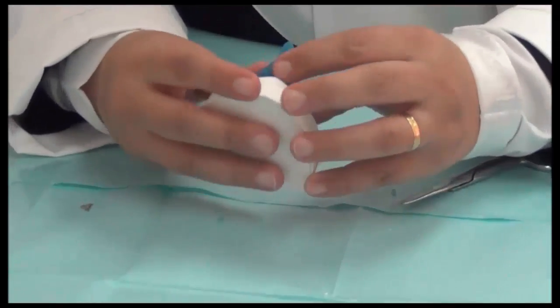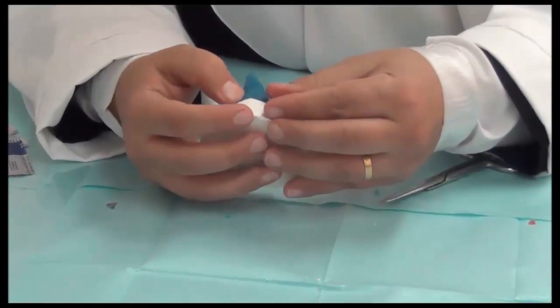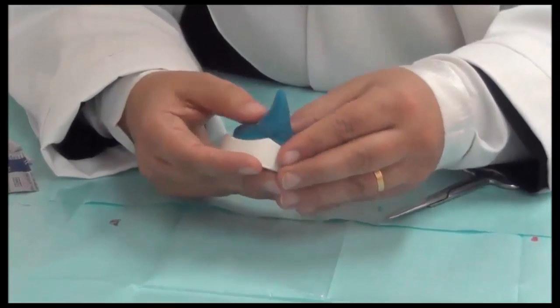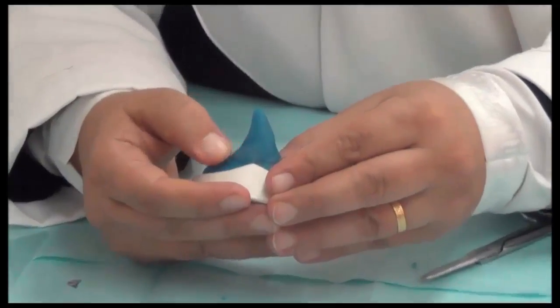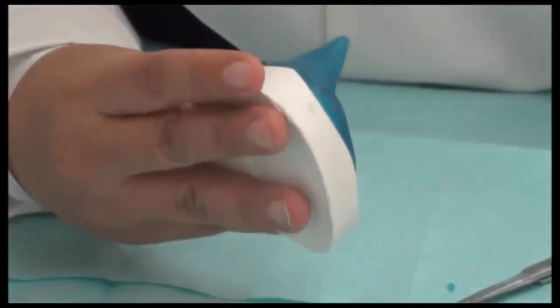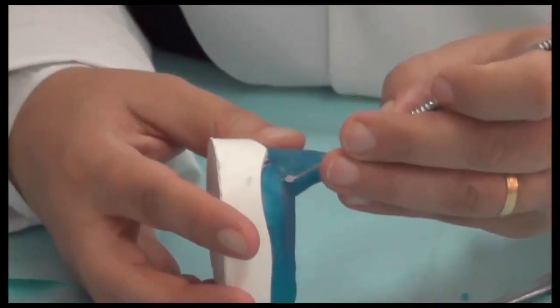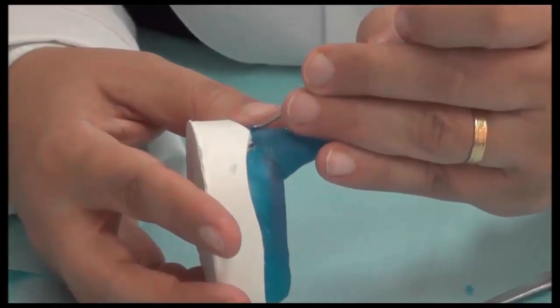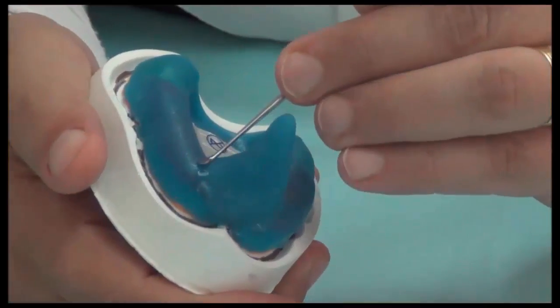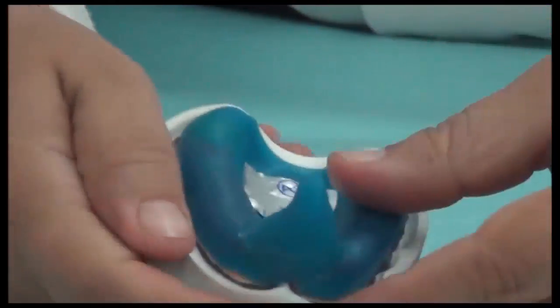Once we have adapted it like this, we keep pressing on the sides until the junction between the handle and the tray becomes smooth. We don't see any lines between the two materials. So this is the first addition. We make sure that from all sides the parts are fused together.